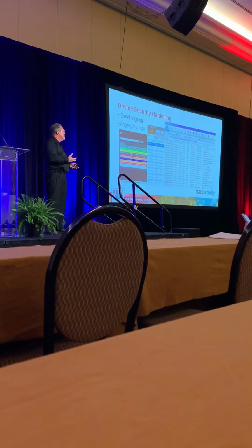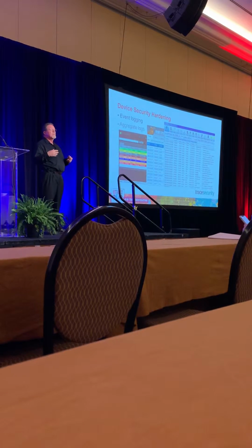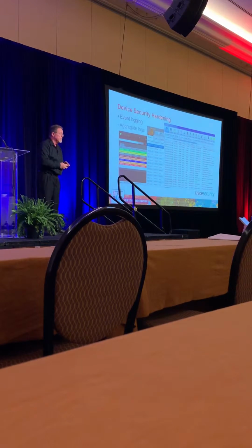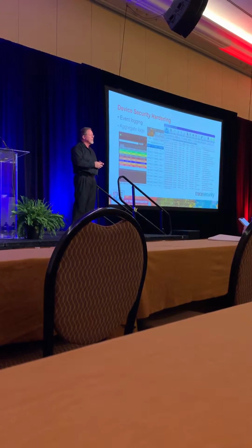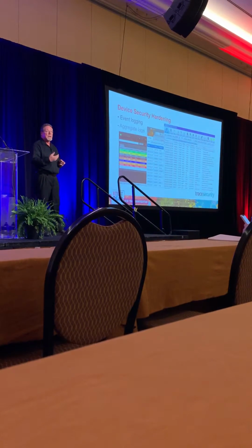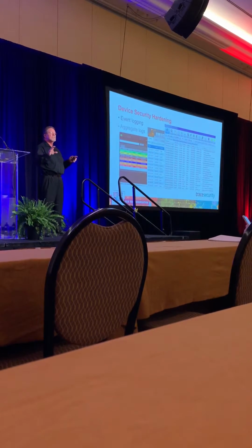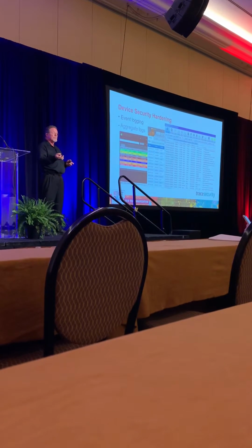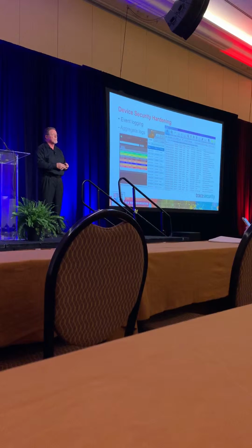So, for example, if you use some type of tool to aggregate the log data, you may be able to use something like a security information event management system. It's become almost a dirty word in some parts of the industry because they take time to implement and they take time to manage. But the thing about those systems is that they can listen to multiple logs, identify events based on predefined rules, and alert the staff on the highest priority events.